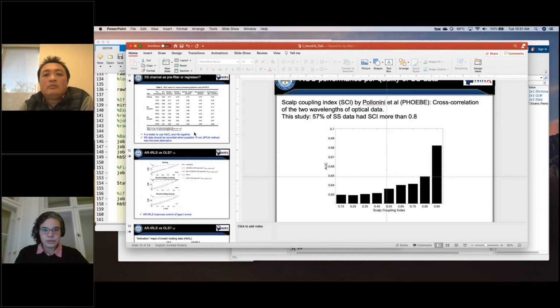Is it the first component only for the PCA? It depends. In my experience, I use 4 to 5 components, but in the paper, we set the threshold at 0.8. It means when the components explain about 80% of the variance of the data, we use those components. So we use the first couple of components, 1, 2, and after 4, at 80% of the variance, we stop, because when we add more, the sensitivity will be reduced.